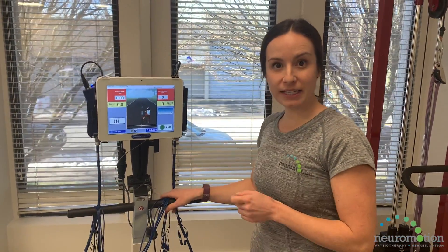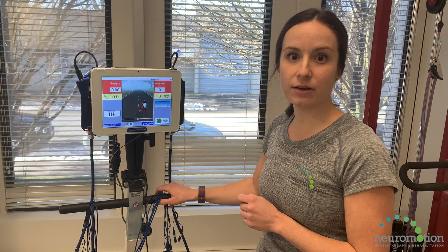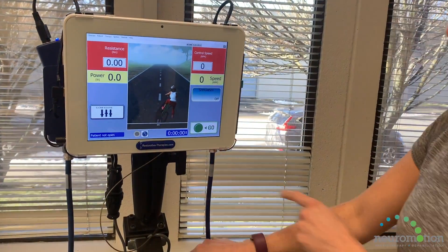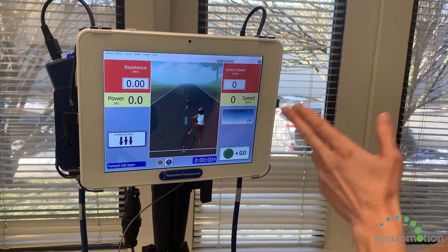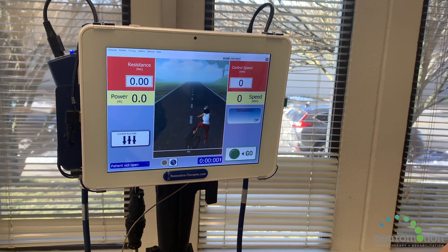Our FES bike here in Victoria is made by Restorative Therapies — it is the RT300 model. Here on the screen, this is called the SAGE controller. This is where you can see each individual patient's information such as speed, how much stimulation they're getting, their resistance, and their power output.